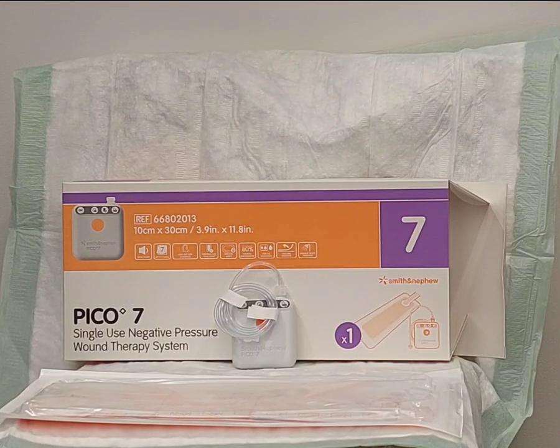Contraindications for Pico are similar to other negative pressure wound therapies, including known malignancy in the wound, osteomyelitis, unexplored fistulas, and exposed blood vessels, nerves, or anastomotic sites.